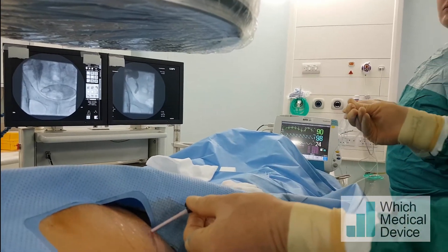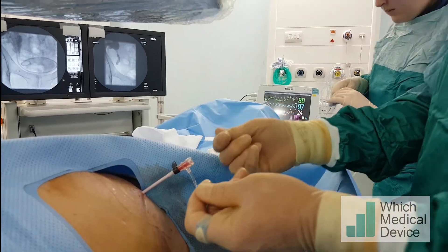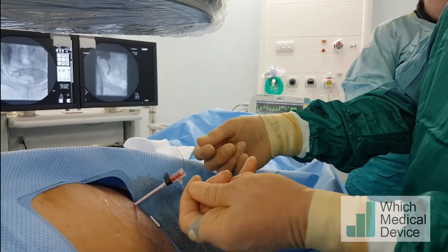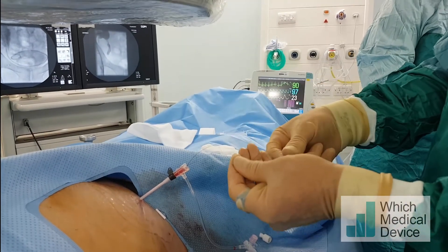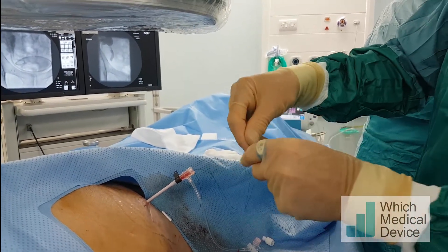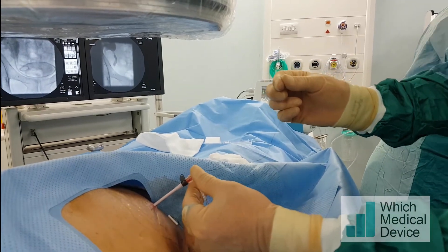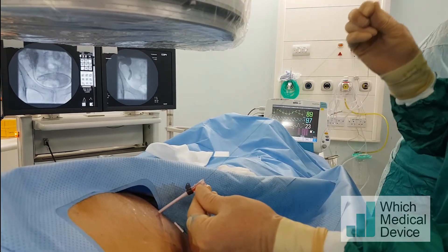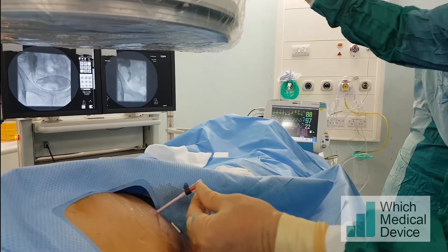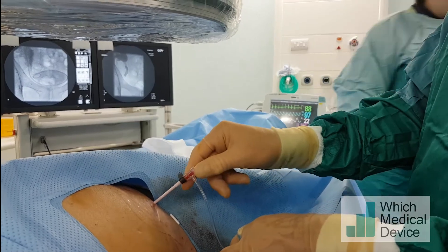I'm now taking the wire out, leaving the sheath in situ. I'm going to snap the thread and pull the knotted end back through the top of the stent, which will not pull the stent back with it. That's the thread out. Now we can reinsert our guide wire and place a nephrostomy through this sheath.